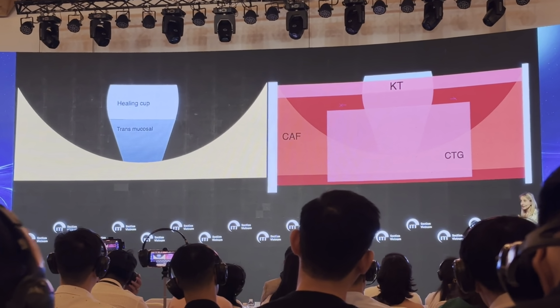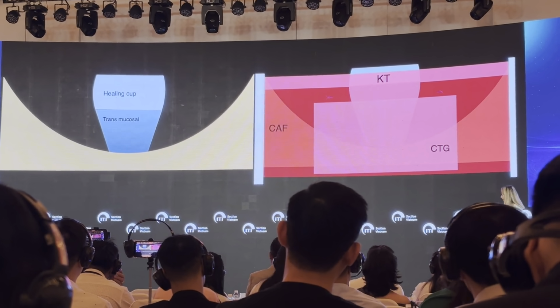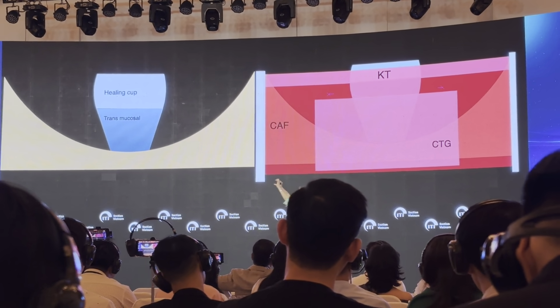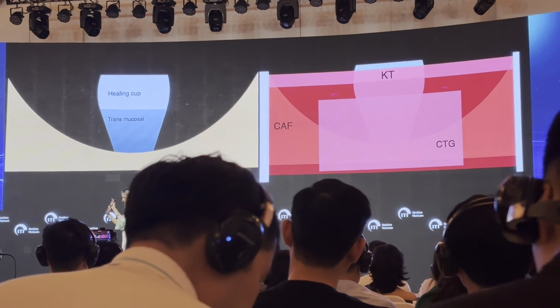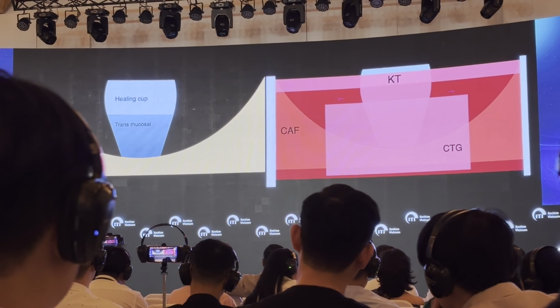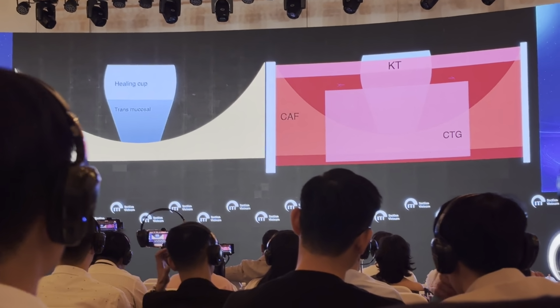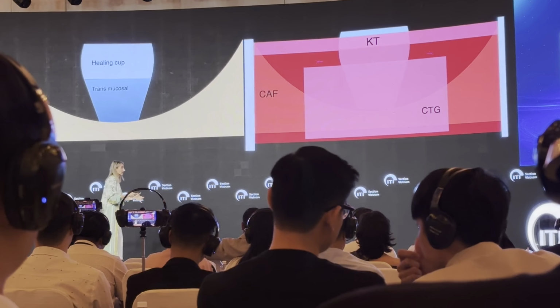So I will fix the connective tissue graft to the inner aspect of my flap, 1 millimeter paramarginal, maintaining the keratinized tissue of the flap free without the connective tissue graft, covering the tissue level component of the implant and applying 2 millimeters of connective tissue graft on the buccal bone to compensate for the buccal lingual defect.